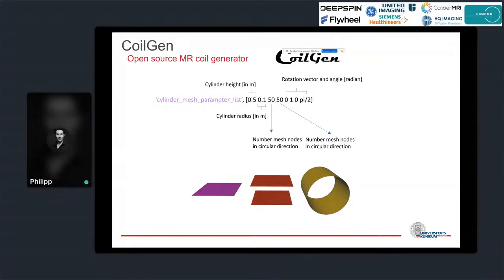Furthermore, you can specify the orientation of the cylinder. In the last 4 inputs, there are these vector entries, so you can rotate your cylinder in any direction you want, and with just that rotation you can go from a normal gradient to a Halbach gradient by rotating the cylinder by pi/2. So it's just one change of the input, and you get the Halbach configuration.